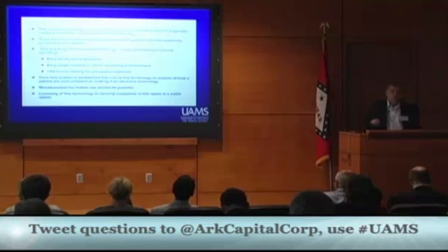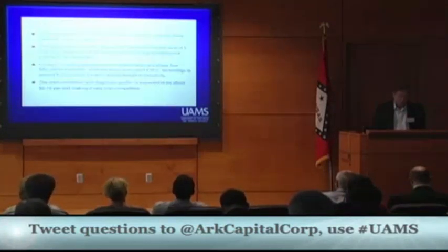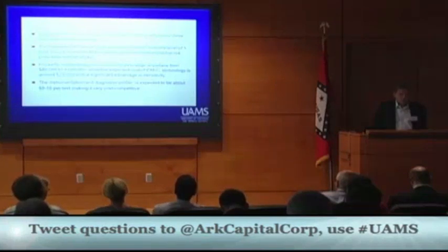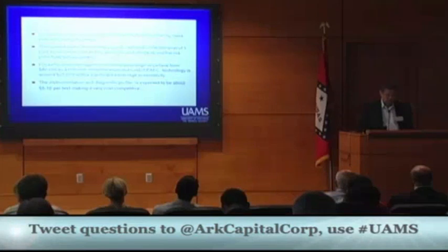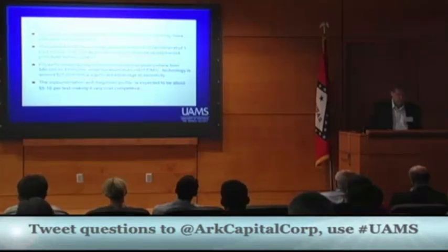The question is, could we detect small clots, what size? That is what we are working on right now. Clinics have pulse Doppler ultrasound. Sometimes it helps. But if you are familiar with ultrasound, there are a lot of artifacts and noise, and a possibility to detect only large clots. But it works. That's why we can compare.